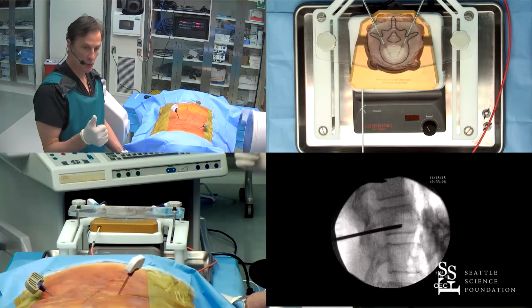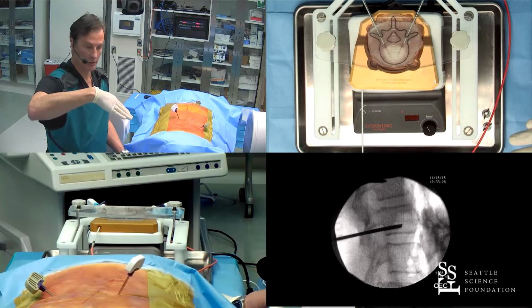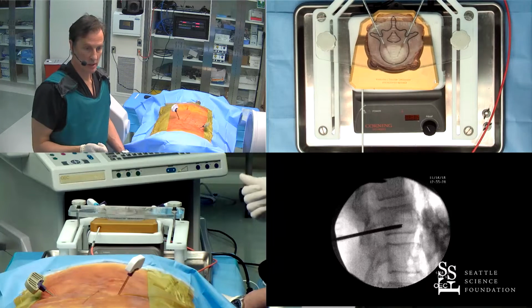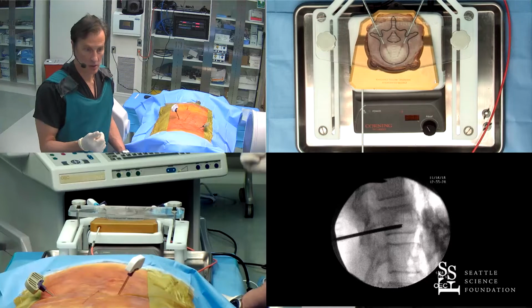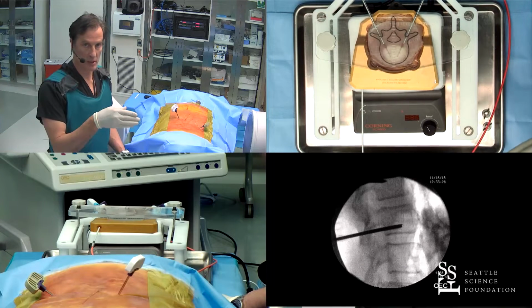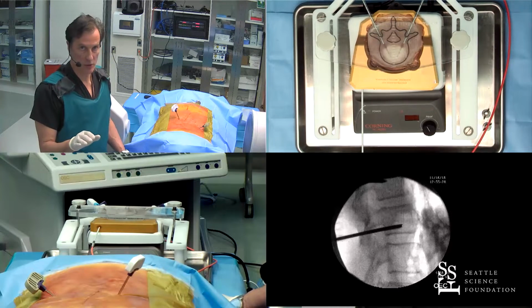This is designed for things like severe vertebral plana, where you can't access it from a top-down approach, from a 10 o'clock and 2 o'clock transpedicular approach. It's designed for hardware, which is the biggest advantage, and for getting around a tumor. So when you have a big 5565 screw in the pedicle, and you can't get around it using the perpendicular approach that I just demonstrated, because of the size of the screw, this is a perfect approach for it.